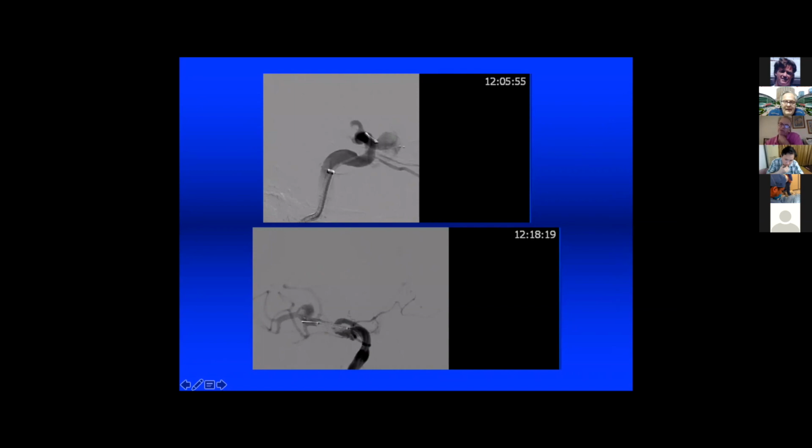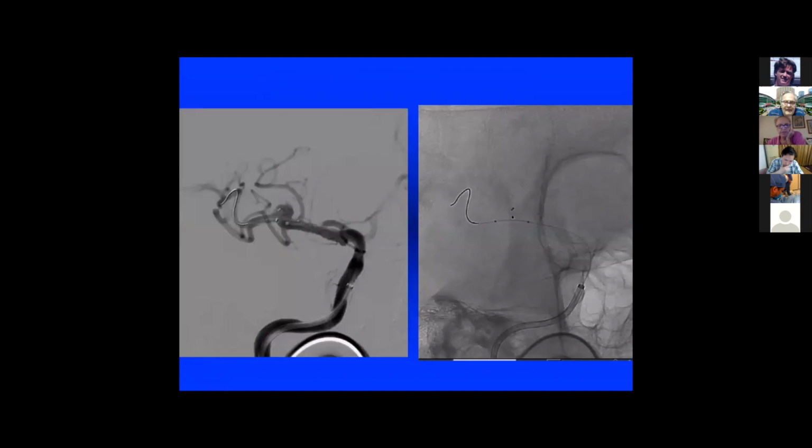Manual compression of the carotid. Reverse the heparin, the anticoagulation. And then I inflate the balloon, I wait a little bit and stop the bleeding, but I have a risk of rebleeding or change of the place of the WEB inside. I decide to put one stent to protect the vessel. This is the WEB.